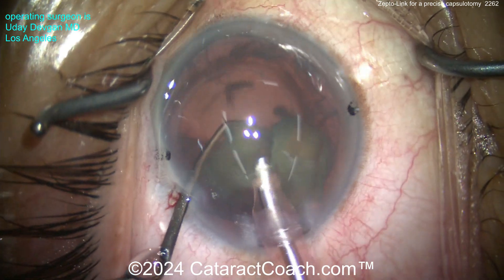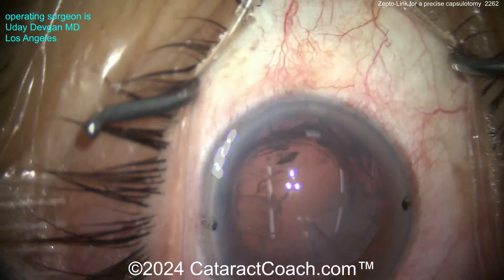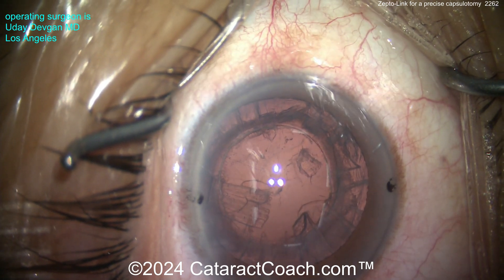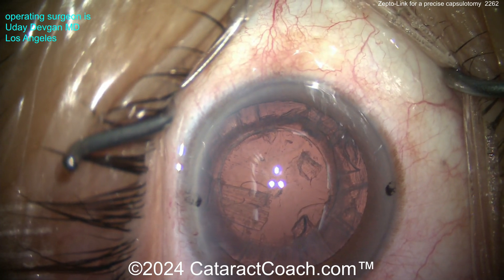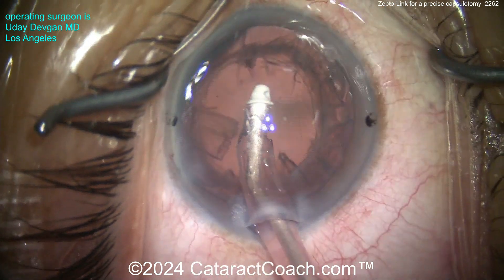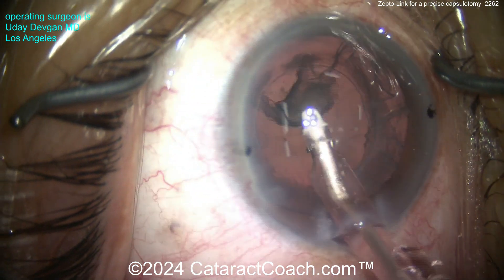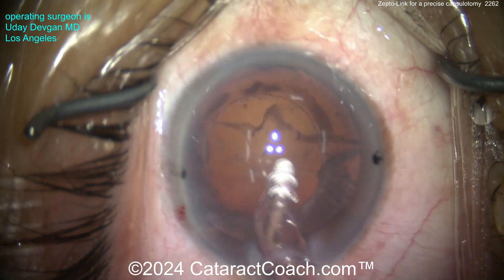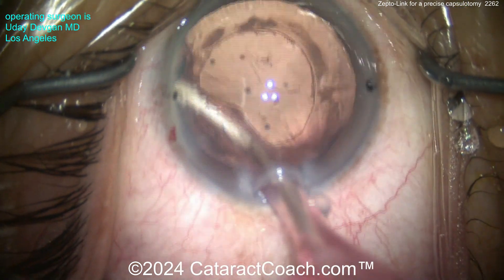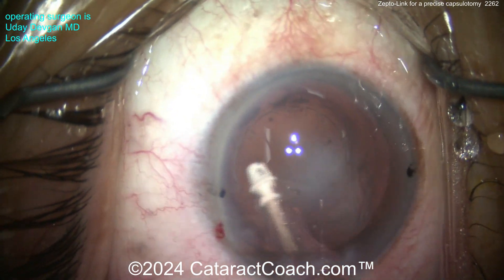Remember — four milliseconds, so many many times faster than a femtosecond laser to create that capsular opening, minimizing the risk of Argentinian flag sign. Think about other cases too — loose zonular support, easy to get the capsulotomy done. Even on a routine case like this I can be assured of a great capsular opening that's beautifully round, perfectly centered wherever I place it, and strong — the edges are rolled over and stronger than you can get from a femtosecond laser.